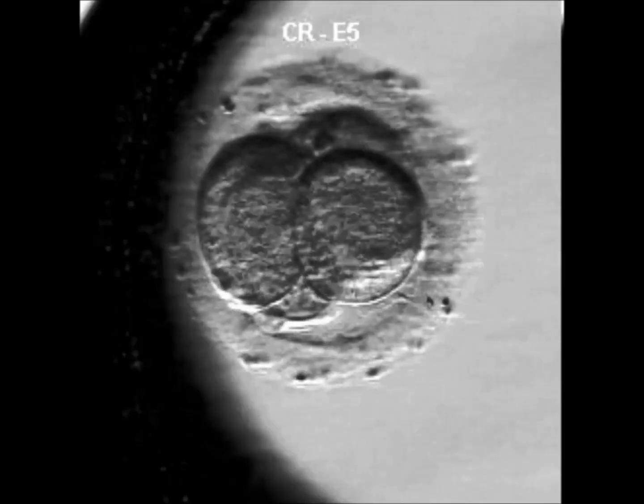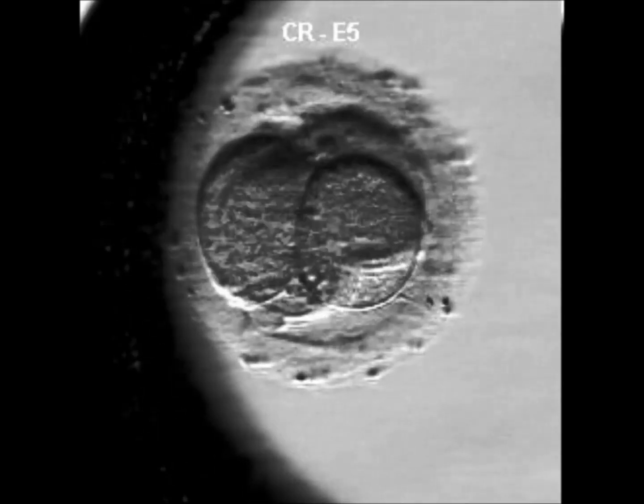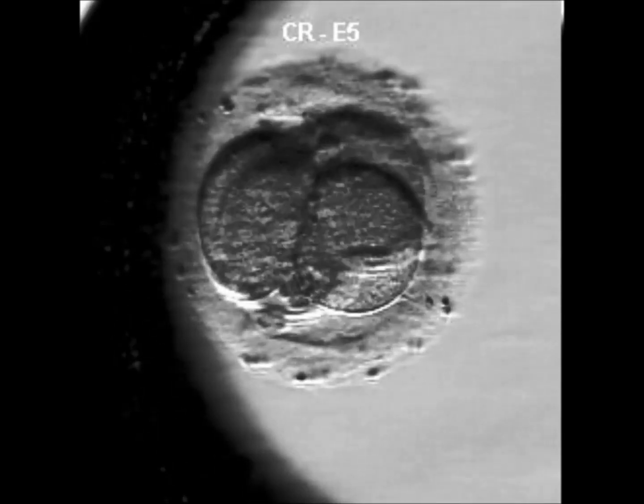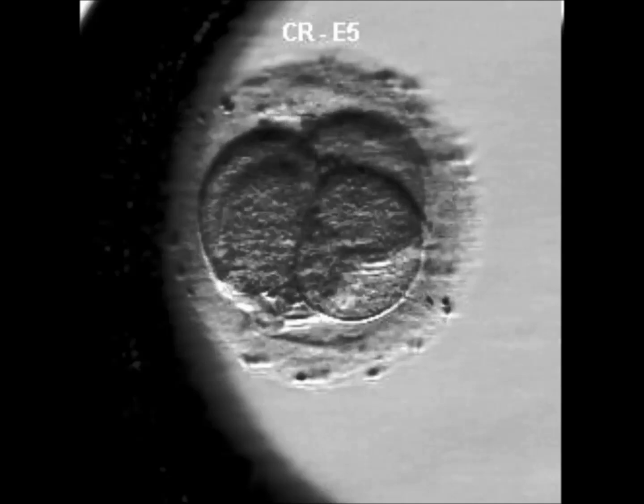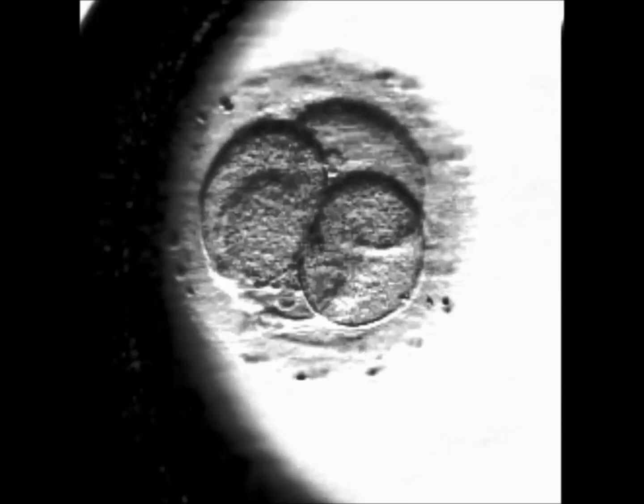Blastomere fusion is another phenomenon that results in a mosaic or abnormal embryo. Here are two examples where cells divide early on only to fuse back together again.